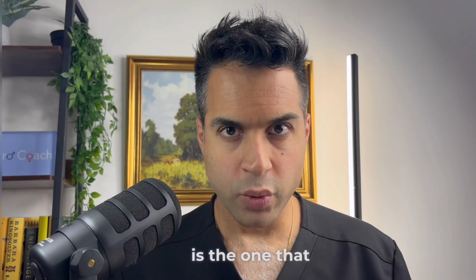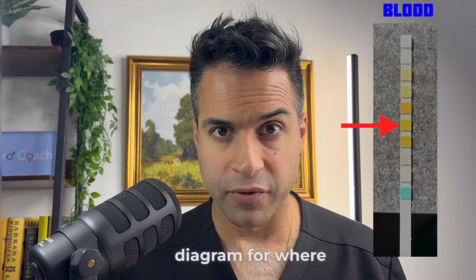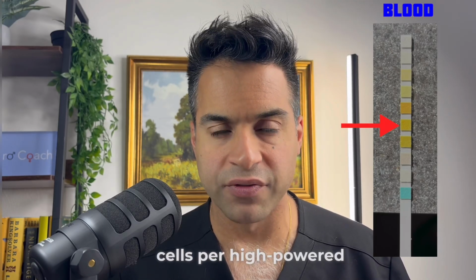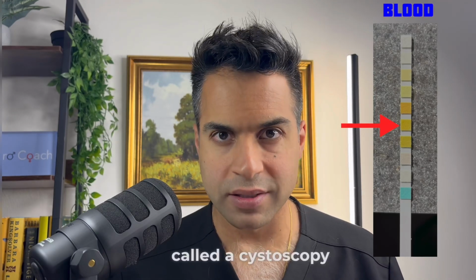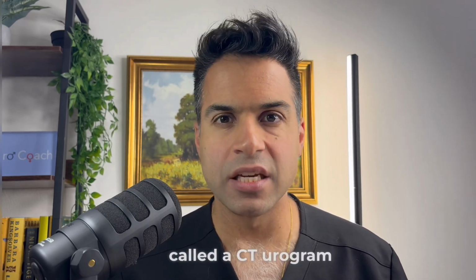Okay, and the next one is the one that people probably freak out about the most, blood in the urine. All right, so look at the diagram for where that is on the urine dipstick. So blood in the urine is defined by greater than 3 red blood cells per high-powered field, and we will usually do a workup for this that involves 2 things: a look inside your bladder with a camera called a cystoscopy, and an image of your upper urinary tracts called a CT urogram.